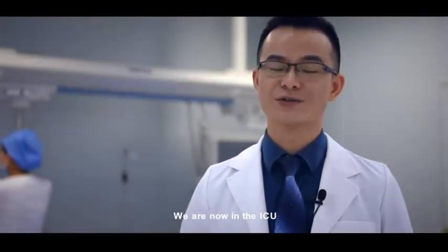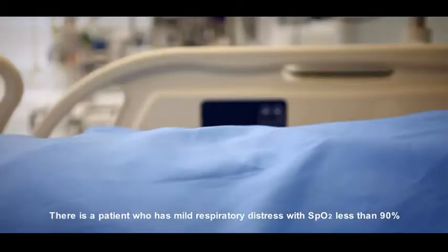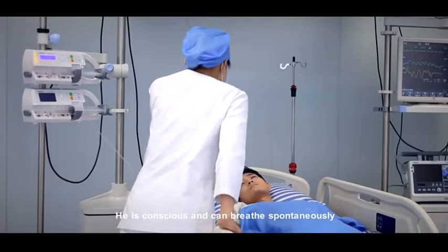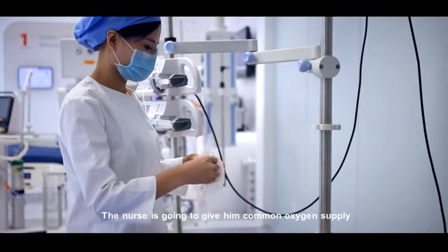We are now in the ICU. There is a patient who has mild respiratory distress with SpO2 less than 90%. He is conscious and can breathe spontaneously. The nurse is going to give him common oxygen supply.